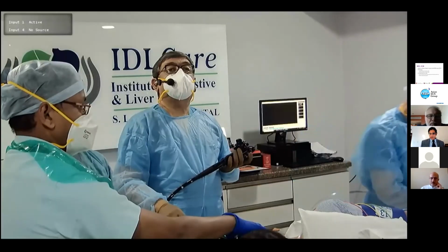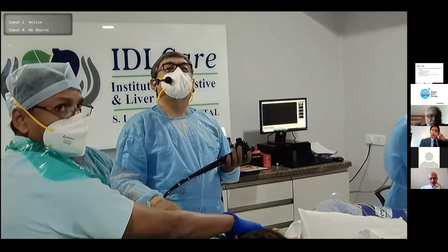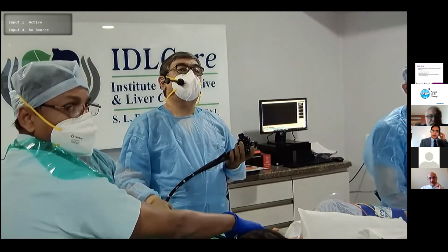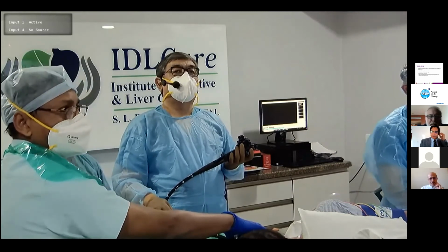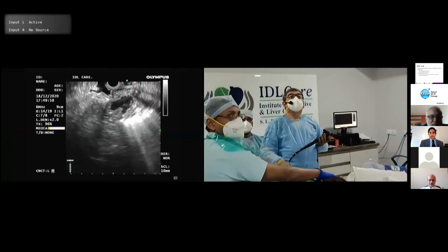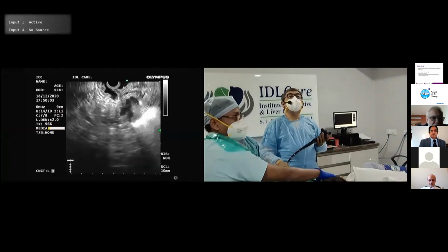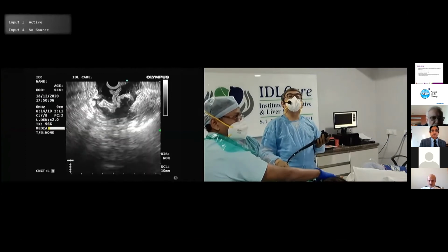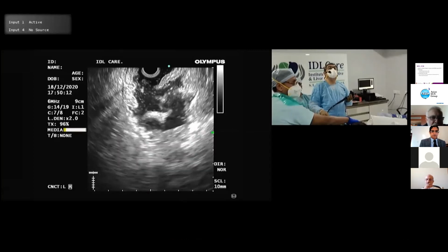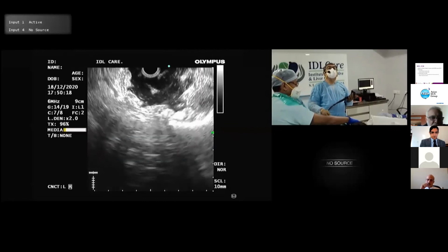So there is a partial kind of outlet obstruction. You see this water in the stomach? I don't have an endoscopy view. We lost it. EUS view, please. Give the EUS view, please. Can we have endoscopy view? No, no. Look at the EUS view. Yeah. See, it gives you more information. It gives you fluid, and it also tells you that the gastric folds are not hypertrophied. That goes against gastrinoma. Normally, the gastric folds will be hypertrophied. See, on EUS, you are not seeing hypertrophic gastric folds, right? These are normal gastric folds that we are seeing.